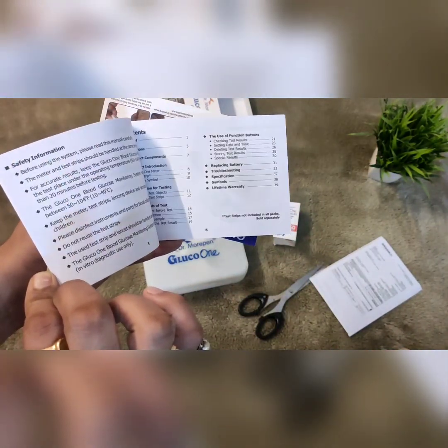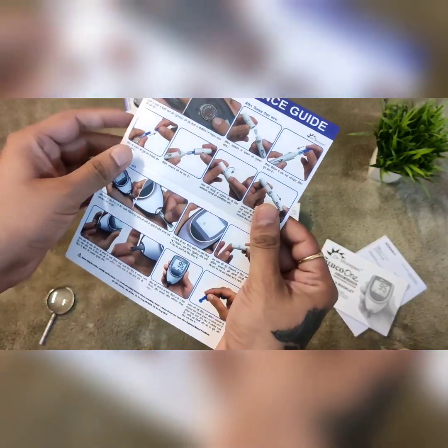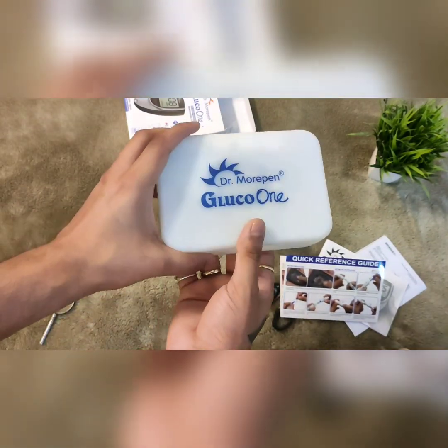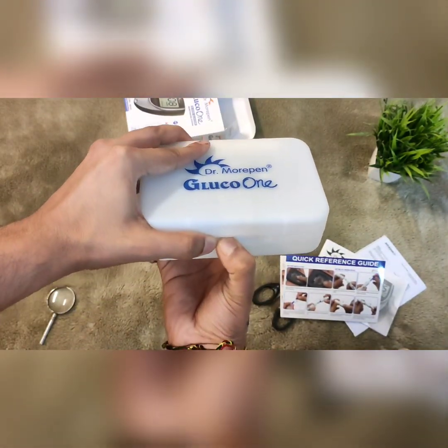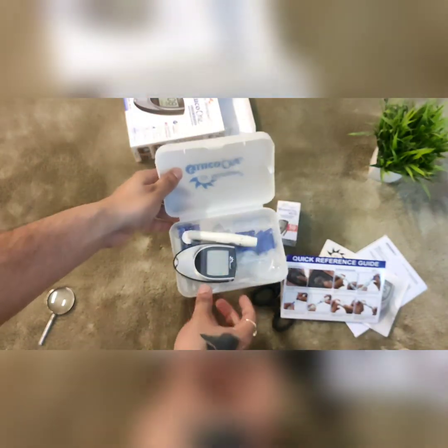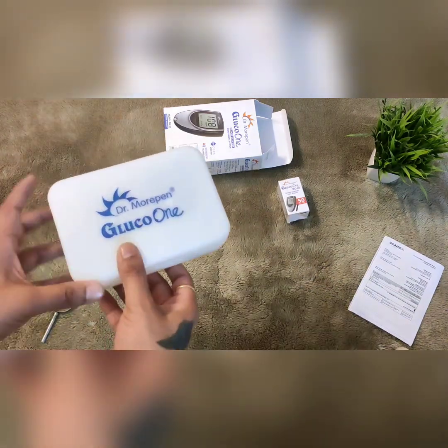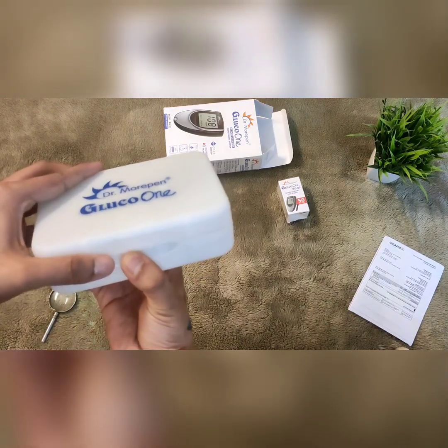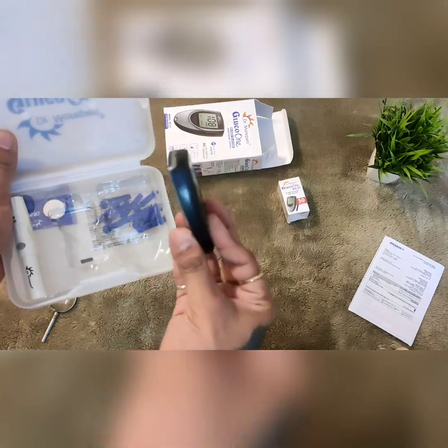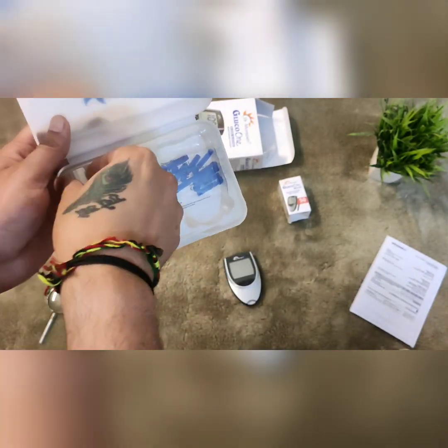Here we have got this new guide booklet which you can see and take help from and use accordingly. Here you can see the glucometer box — it has very good packaging and comes in a plastic box. This is the glucometer device, as you can see it clearly — a very small, handy device.